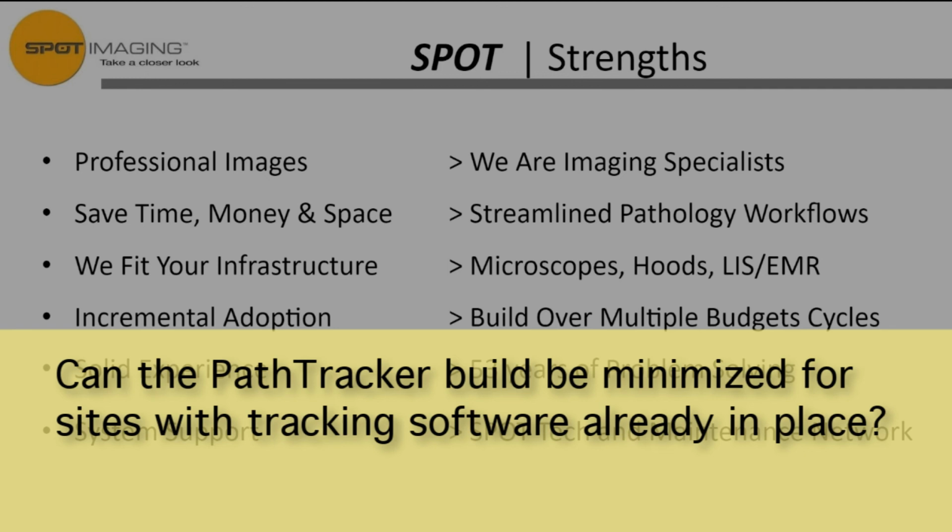When we put the automatic purge on, we can put a time frame on it so that the software and the search capability that we have in the PathTracker software is available for you. And what we can do is, after a month or so, you can set up the time limit actually, that it'll just go back and delete the data and the images after that time.